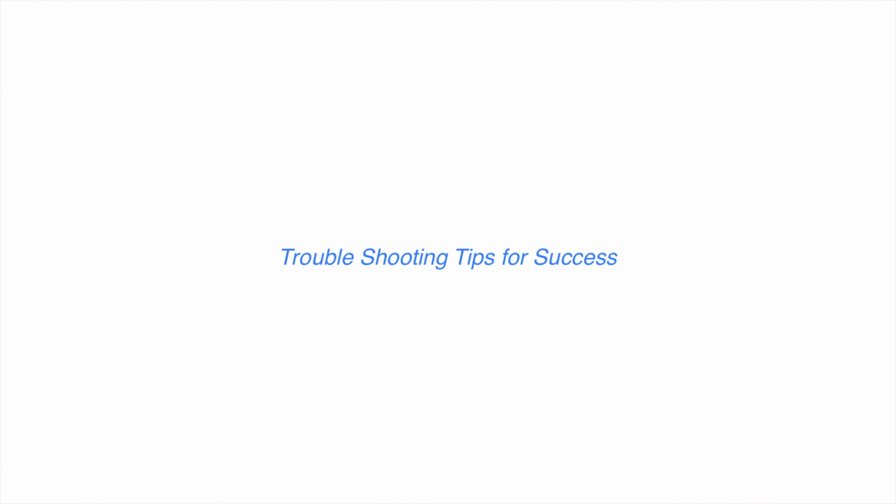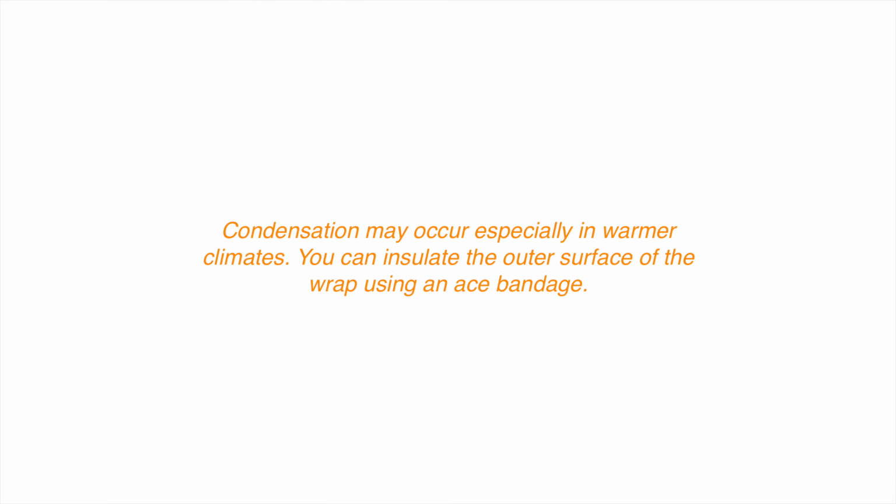Here are some tips for success with your Polar Care unit. It is common for there to be condensation both on the hose and the wrap of your unit, especially in a warmer climate. You can insulate these as necessary to prevent the condensation. It is important to notice if your hose is kinked, because this can decrease the water that's moving to the wrap. Be sure that there are no kinks in your hose while using the unit.